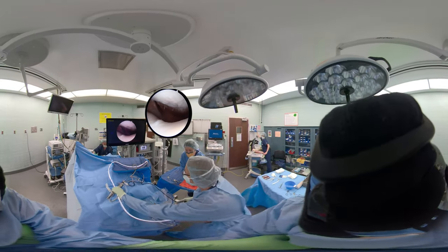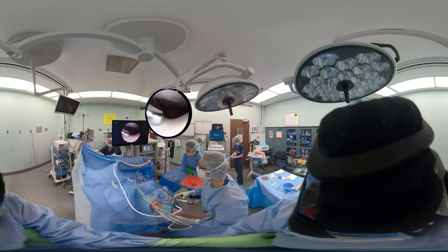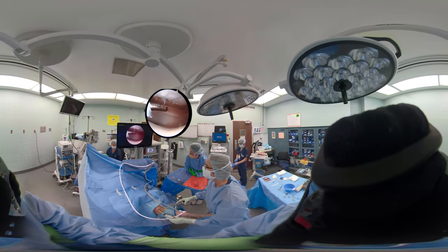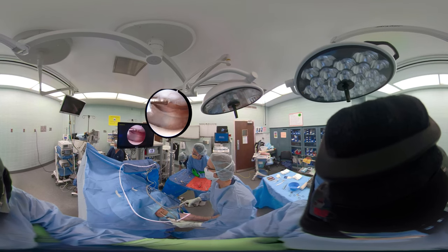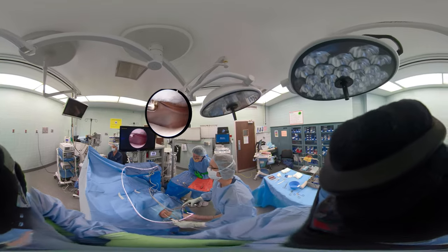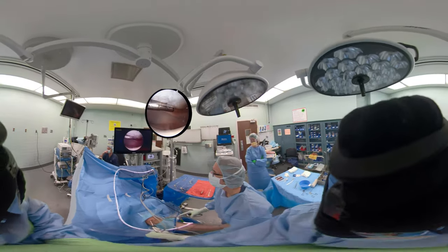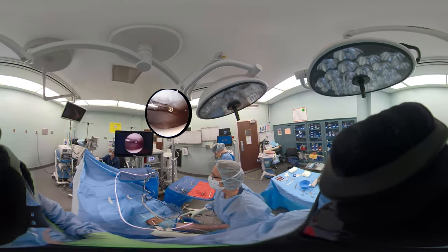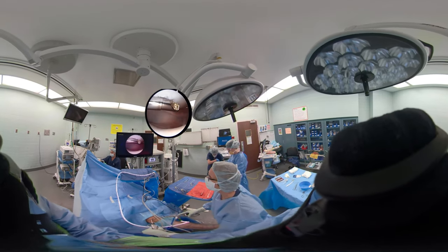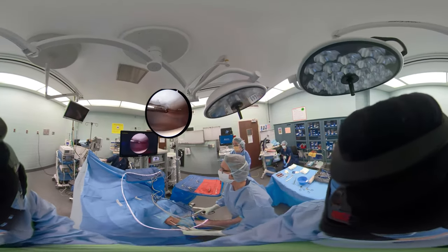Now we have the scope and a curved shaver. If we put that shaver in at the same degree of knee flexion, it goes in easily. Make a big enough medial portal so you're not struggling to get your instruments back in. When doing articular cartilage debridement, we have the shaver on oscillate. I'm coming in perpendicular — not making any larger defect in the articular cartilage — just getting rid of any loose edges or hanging pieces. This is a debridement, not a formal chondroplasty of the patella. That's where the loose body came from when she dislocated her patella.